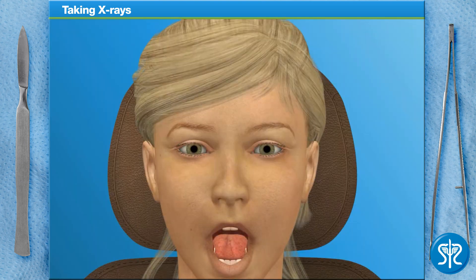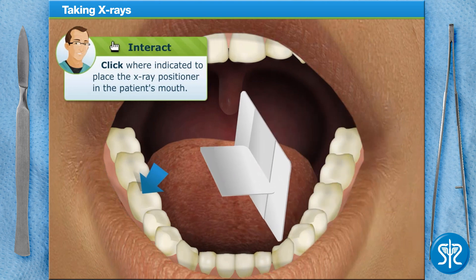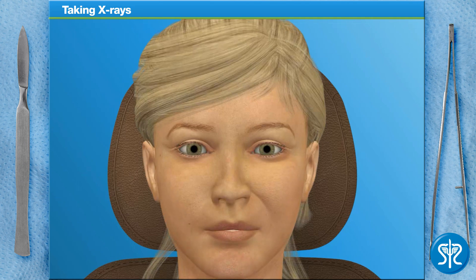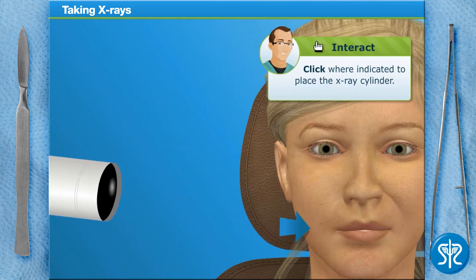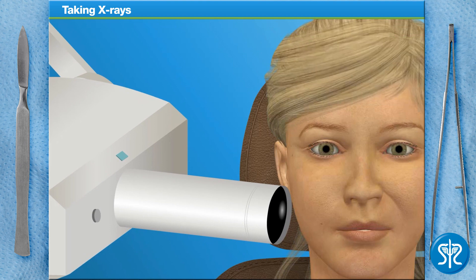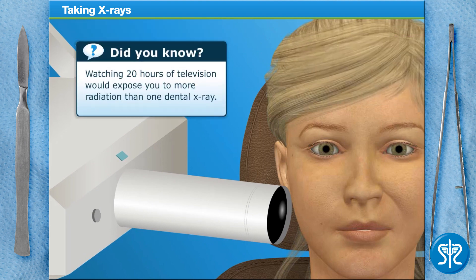First, insert a positioner into the patient's mouth. Next, position the x-ray cylinder where indicated. With the x-ray cylinder in place, we need to get behind our radiation barrier to reduce the amount of radiation we're being exposed to, and take the picture. Don't worry, a lead apron will protect our patient from any unnecessary radiation exposure.